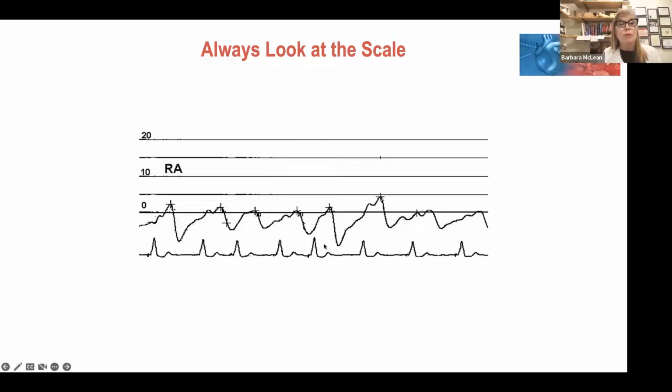And really important to remember, you can indeed have a negative pressure in the right atrium. And there's only one thing that's happening here. As long as you're sure your equipment is right and you are level, you've got 300 millimeters of mercury in your pressure bag, there's no air in your tubing. So check your equipment. But then if all things are right with your equipment and your leveling, this is a patient, and there's only one answer here, profoundly hypovolemic. Okay, here's the time when CVP does tell you about volume.